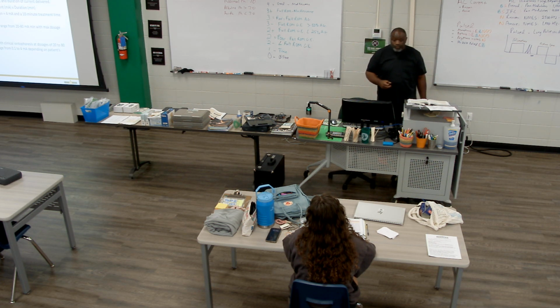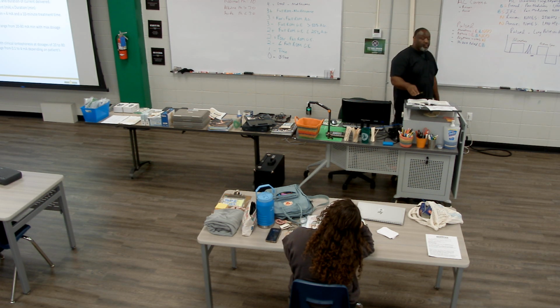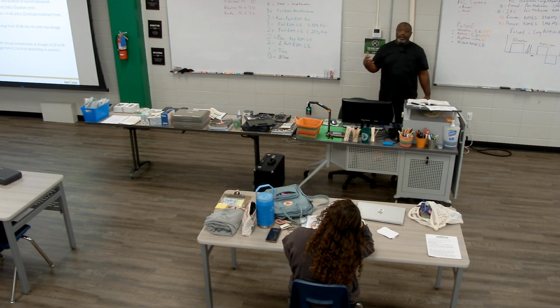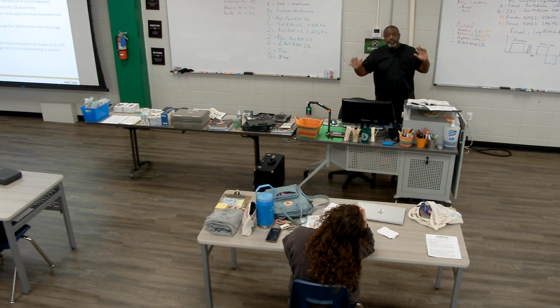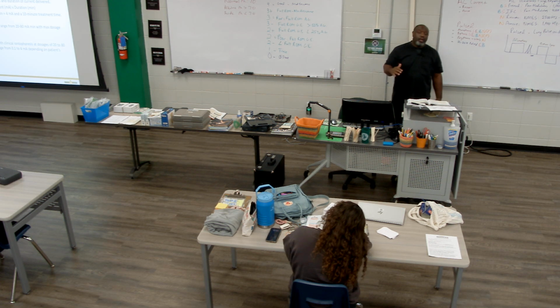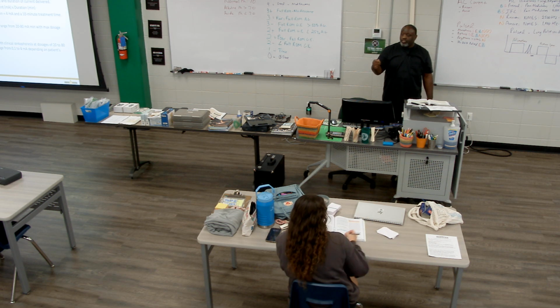Iontophoresis is calculated differently than anything we've done before. So far we've used frequency, amplitude, pulse width, on time, off time, ramp. Those are things we're familiar with. Whereas iontophoresis is measured in dosages, like you're taking dosages of medicine.